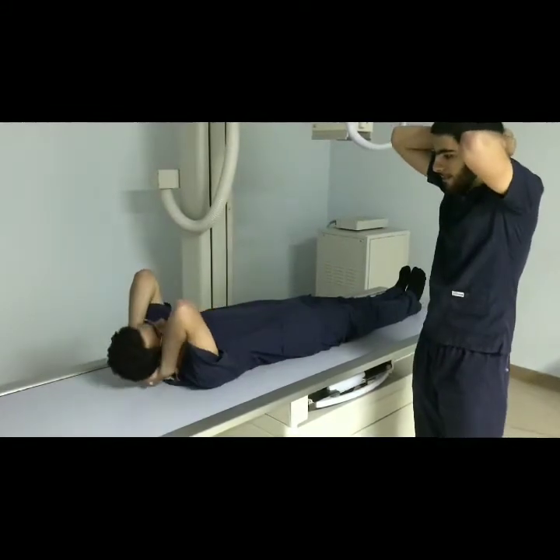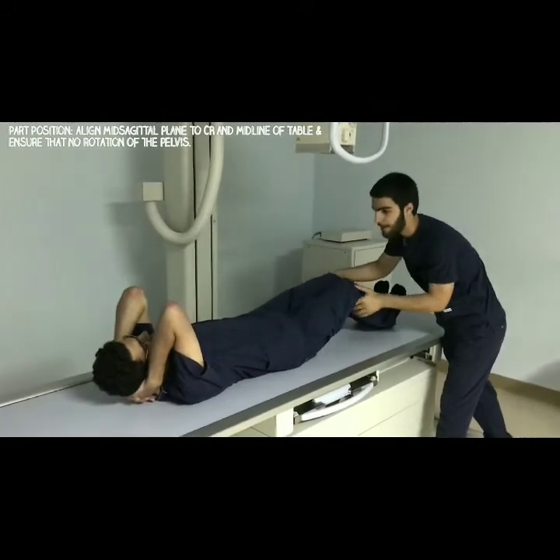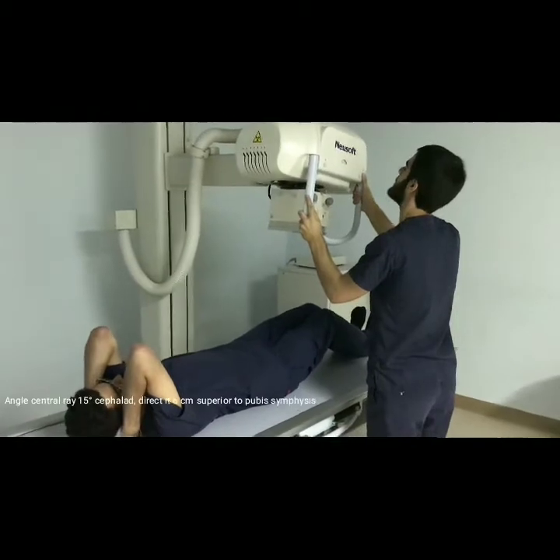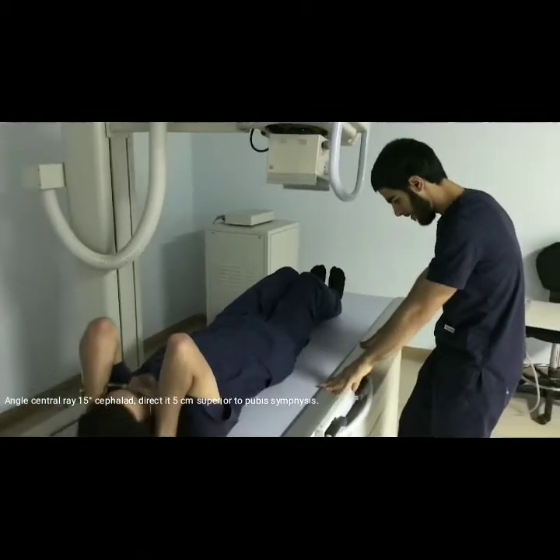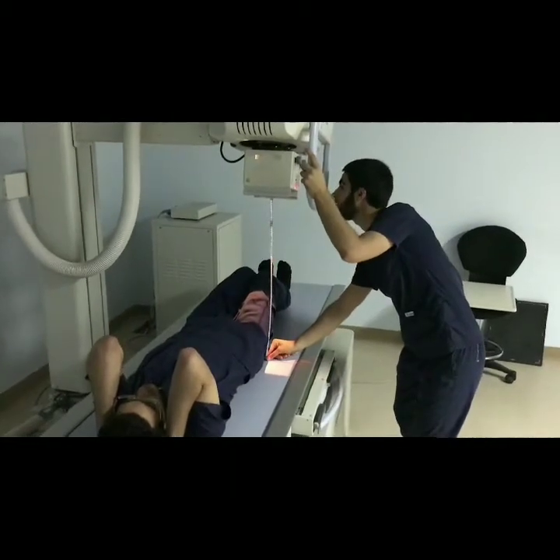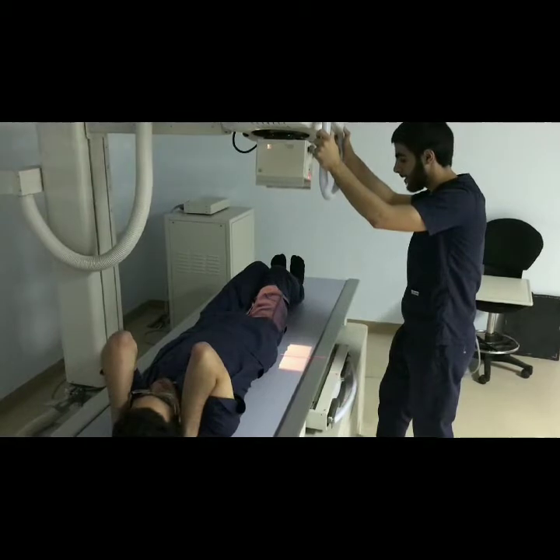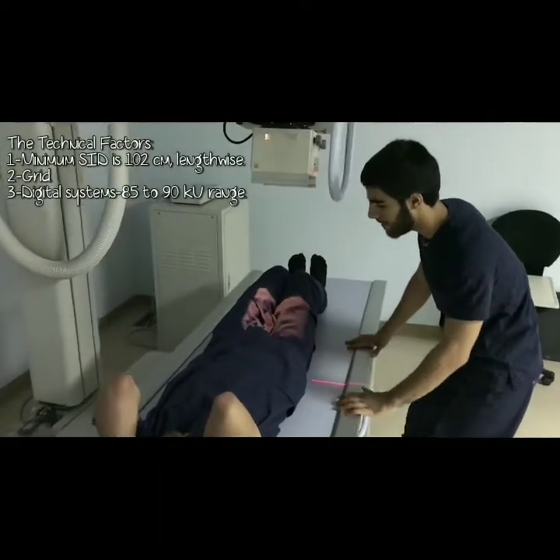Tell the patient what he's supposed to do with his hands during exposure. Flex the knees a bit and place support beneath them if available. Measure the correct SID, which represents source to image receptor distance, and use an angle of 15 degrees for the sacrum axial AP. Sometimes you might want to use the caliper. Align the patient to the middle of the image receptor and the central ray.